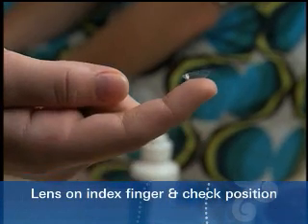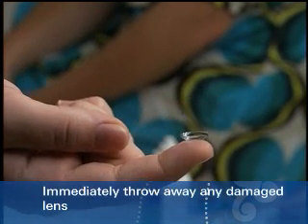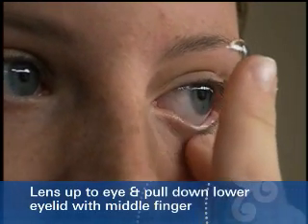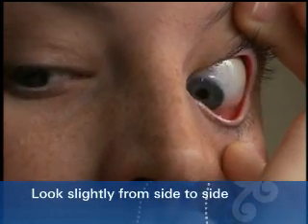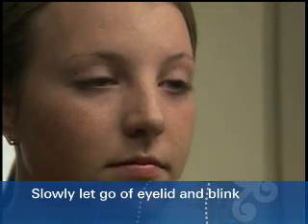Let's see that again — do the other eye and I'll walk you through the steps. Put the lens on your index finger. Check that it's in the correct position and without any damage. Be sure to immediately throw away any damaged lens. Look straight ahead and bring the lens up to your eye. Use your middle finger to pull down the lower eyelid, and the middle finger of your other hand to lift the upper eyelid. Place the lens on your eye, look slightly from side to side, let go of your eyelid slowly, and gently close your eye. Blink a few times and there you go. If you don't get it the first time, don't be disappointed. It might take a little practice before you're really comfortable. Stick with it — you'll get it pretty soon.